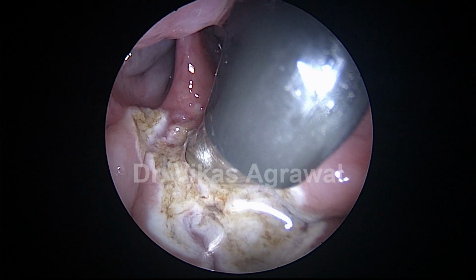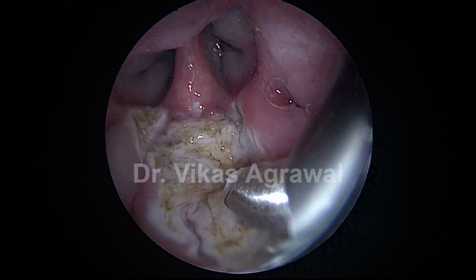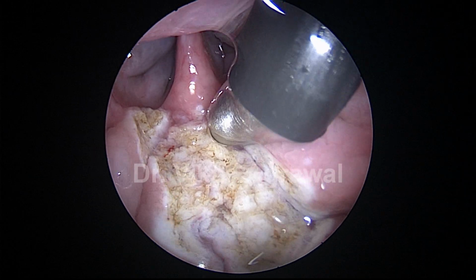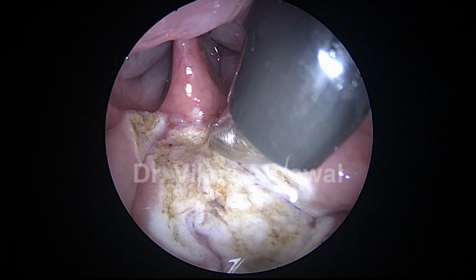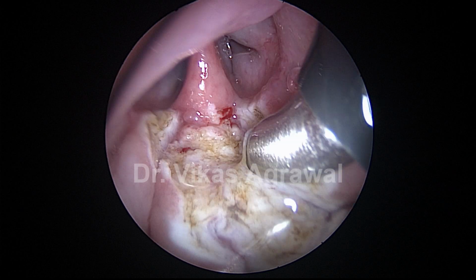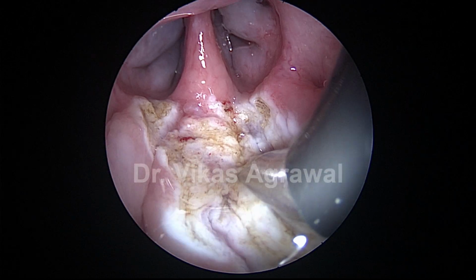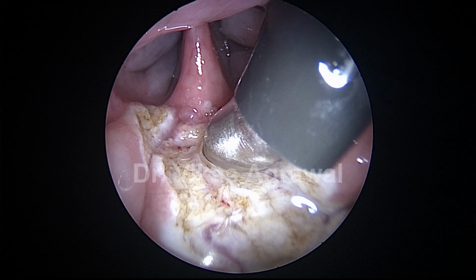Now when I go into the depth here, superiorly I'll get the periosteum below the sphenoid sinus in this part, which is my superior boundary. I've still not got it.